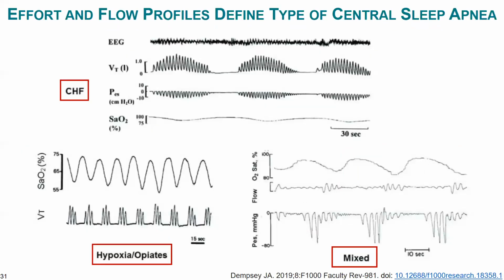And it's because of that that we really can recognize on sleep studies, when we look at the recordings, three distinct patterns that suggest an underlying central sleep apnea diathesis. We've spoken about heart failure and atrial fibrillation, where ventilation, if you will, often waxes and wanes. And when it wanes, we see the central apnea, the absence of respiratory effort. But this is really the purely sinusoidal pattern, completely symmetric. We also see a very, very symmetric pattern in people who have cluster breathing, oftentimes on opiates.